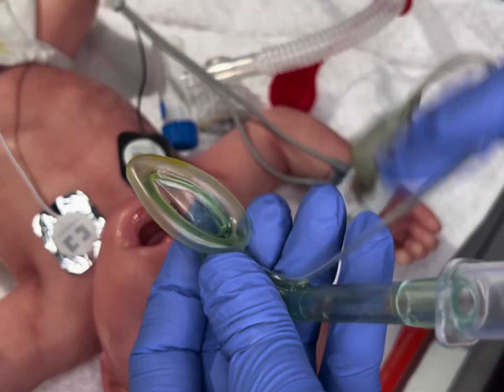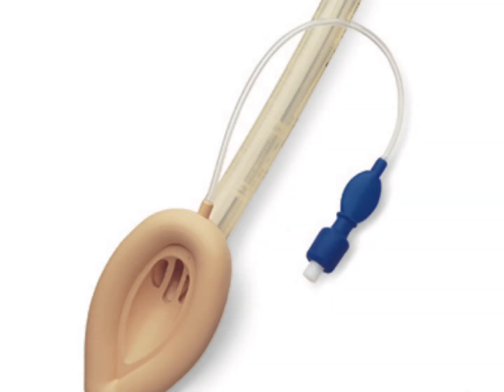Keep in mind that catheters pass much easier in LMAs such as this one, where there is no webbing down at the glottic opening. On the other hand, there are LMAs that have webbing at the end and may make it difficult for the catheter to pass through, which surfactant or epinephrine would be instilled.